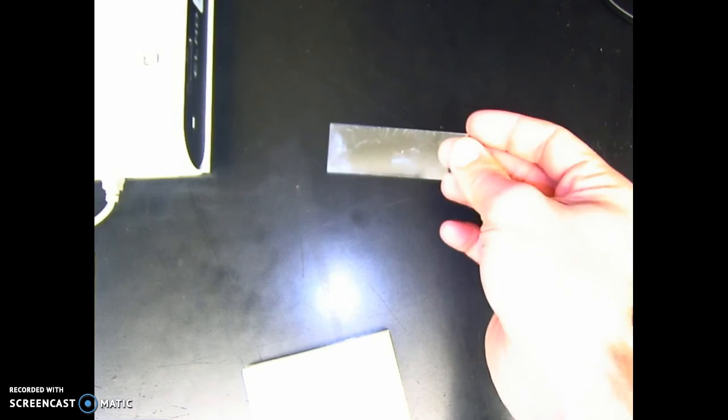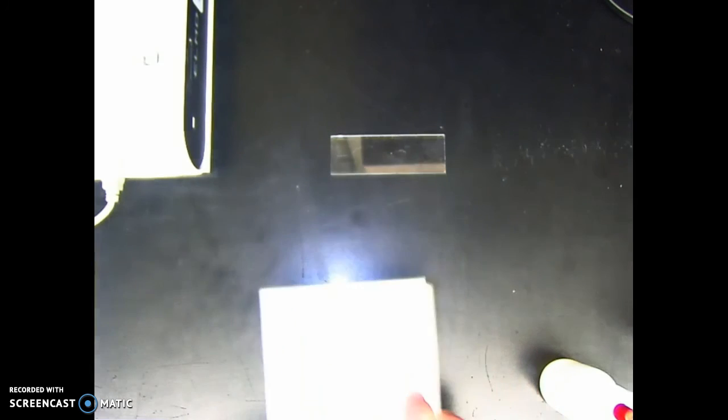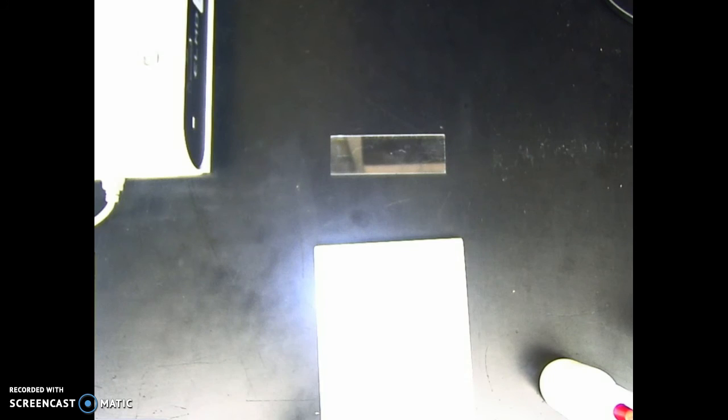A white change might be a little more difficult to see because of the background. That's why I often stick to the slide, because you can really see whether it changes yellow. Yellow is going to be easy to pick up on both, but if it changes to white, you may not be able to pick it up so easily on these little well plates. Okay? So go through there, and it's trial and error. You really have to see what's working. You don't go into this with as much understanding until you really start mixing these bottles together and see what happens.